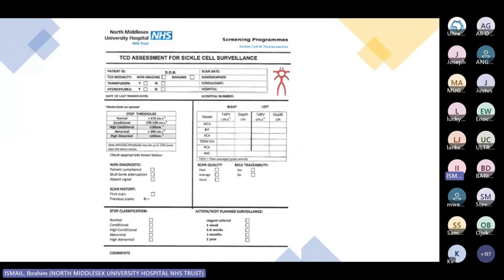If you have had a blood transfusion already, then you're not getting a reflective sample that would show you the probabilities and risk of stroke. So what I would do is schedule my patients who are on active, ongoing blood transfusion to have these TCD scans at least 1 day or a couple of days prior to their next course of blood transfusion.